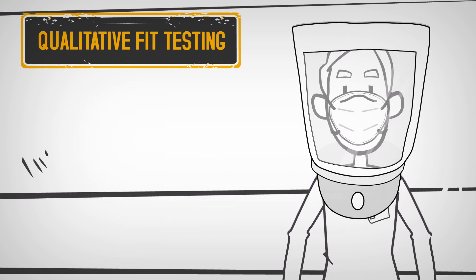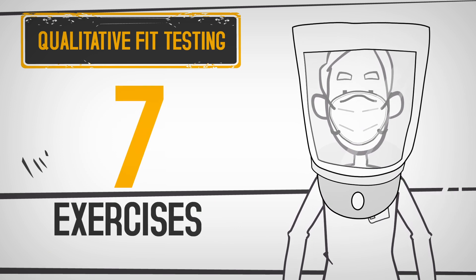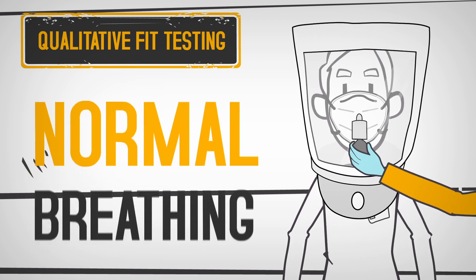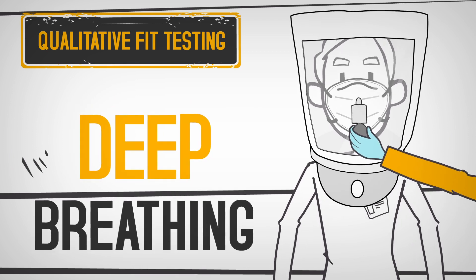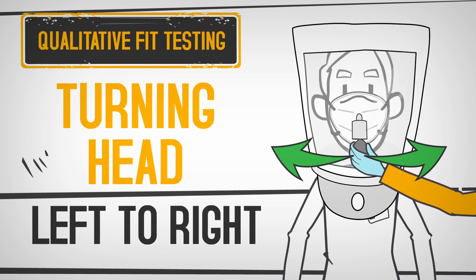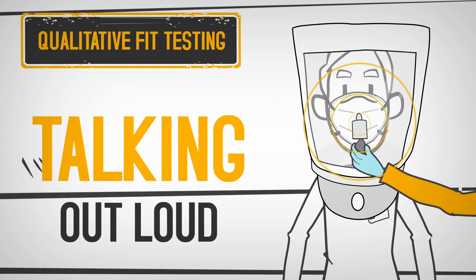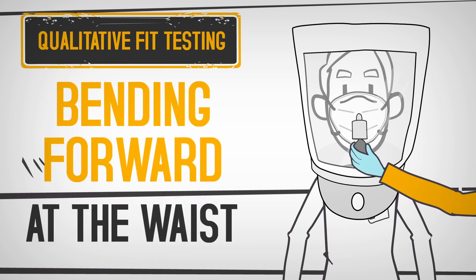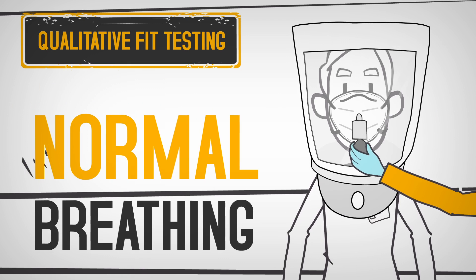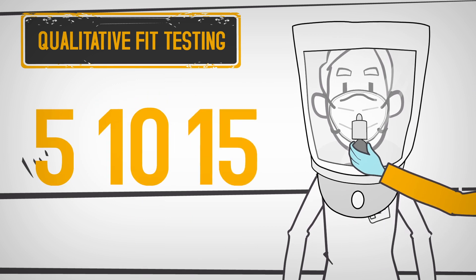From here, you will put on the respirator, and the tester will spray 10, 20, or 30 sprays around the hood while you complete a set of seven exercises: normal breathing, deep breathing, turning your head left to right, nodding up and down, talking out loud, bending forward at the waist, and finishing again with normal breathing. In between each exercise, the tester will spray an additional 5, 10, or 15 sprays.